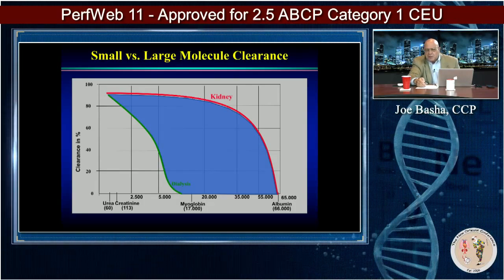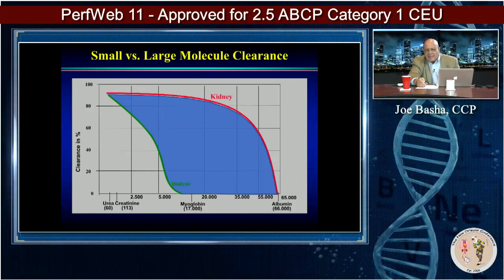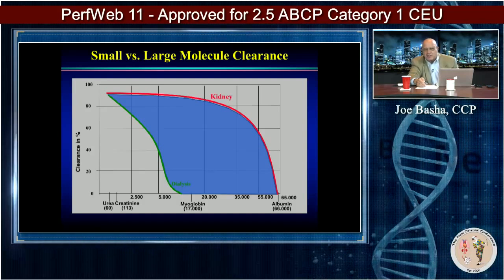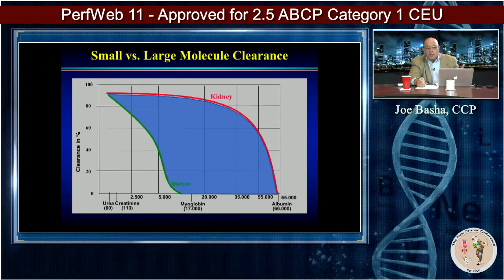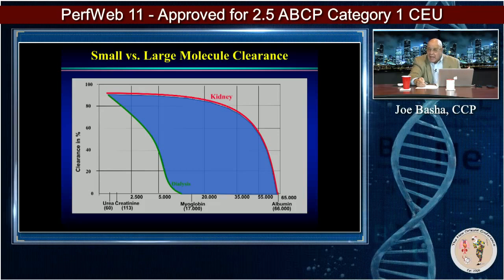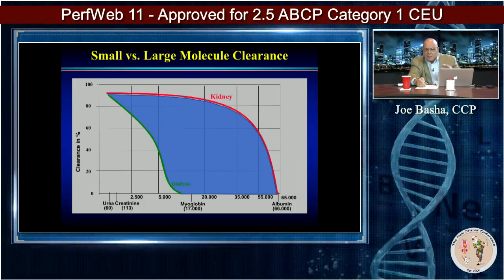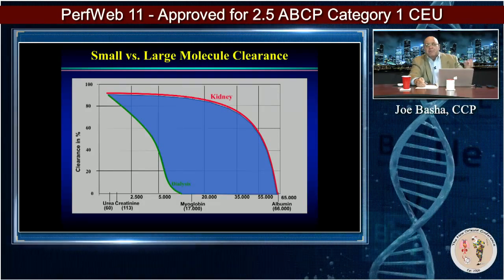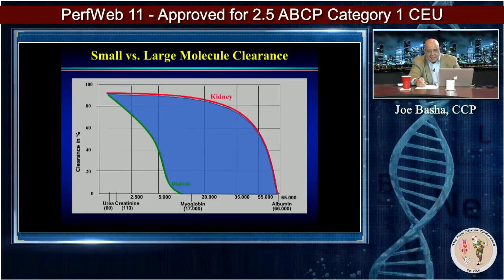But also, if you look at inflammatory mediators, they generally live in the 17, 20, 25, 30, 35,000 Dalton range. Now, there are some that are much, much larger than that, and they need to be removed with adsorption therapy, as opposed to maybe even plasma adsorption therapy, but that's another topic for another day. Right now, we're going to talk about those pro-inflammatory mediators that can be removed. Now, I'll also say, the anti-inflammatory mediators will be removed also, something that you need to take into consideration.